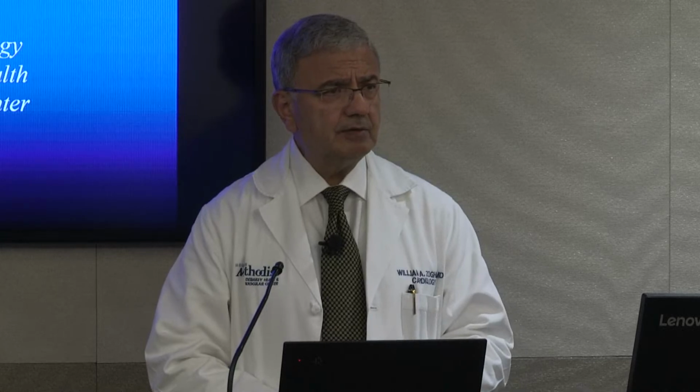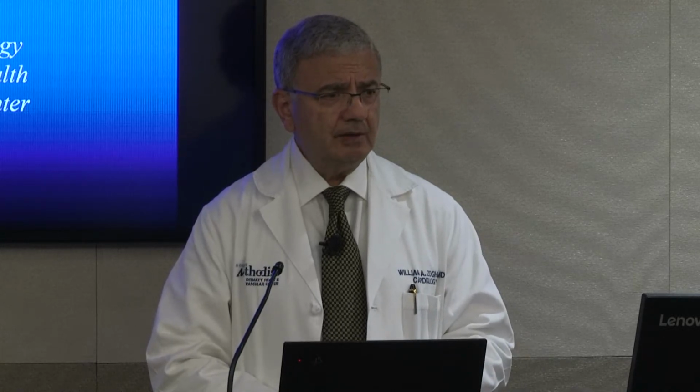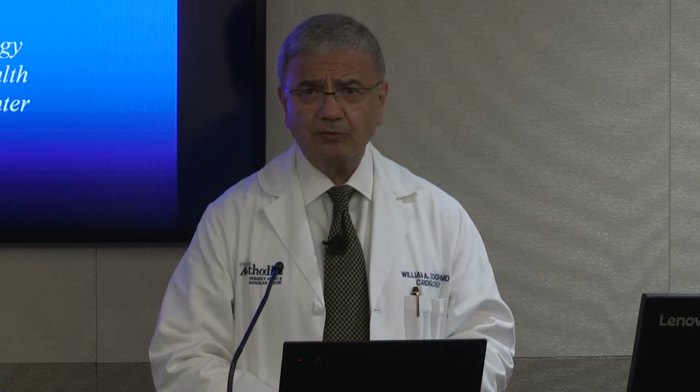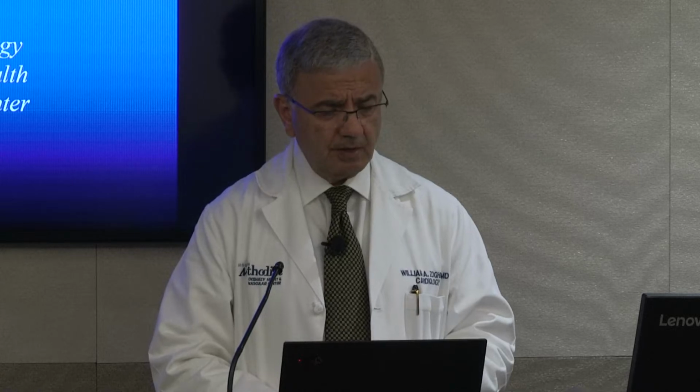It's very interesting that the basic principle of cardiac ultrasound has not changed since its inception in the 50s. You have small waves that are sent. They are beyond the audio range, and that's why it's called ultrasound. So you're talking about megahertz as opposed to kilohertz.